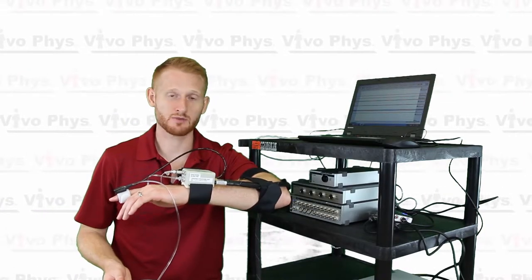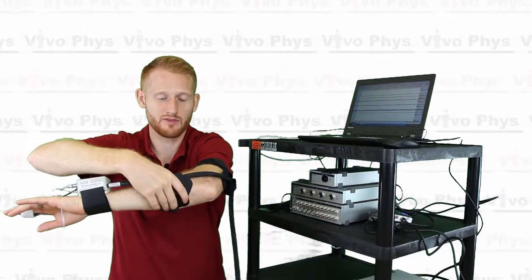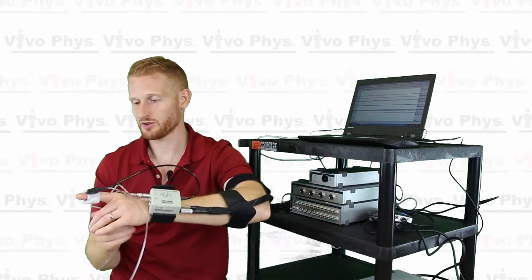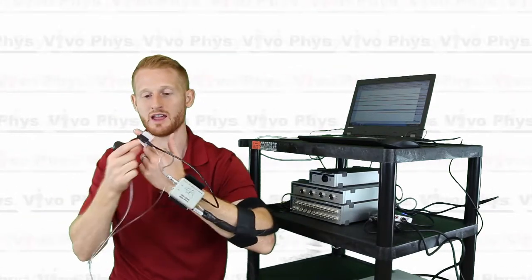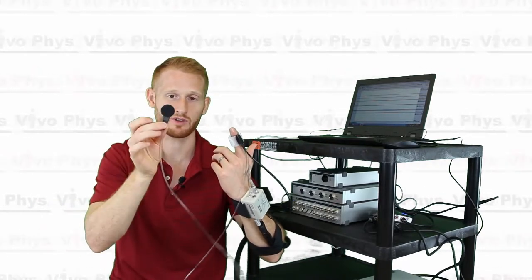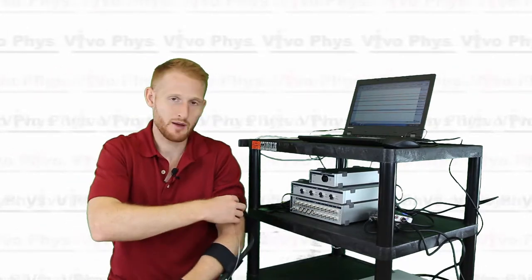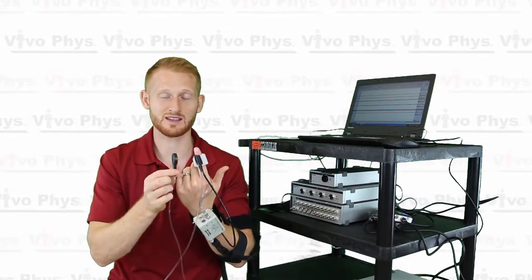The arm setup is now complete. I have the finger cuff on, the wrist unit strapped on with Velcro, an additional strap around my forearm to keep the cord stable and prevent it from pulling on the wrist unit, and one more strap on my upper arm. The height sensor is plugged into the back of the wrist unit, one part attached to the finger cuff via Velcro, and the other part — which I'm holding in my right hand — will be attached to my upper arm strap at the level of the right atrium, once the software calibration is done.